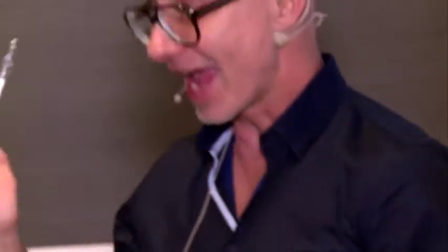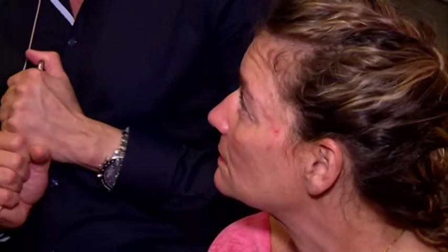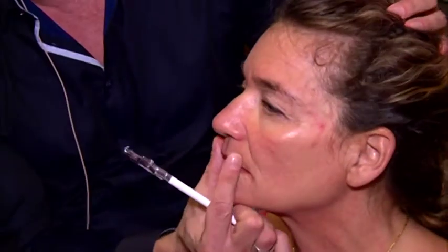Okay. Yeah. And remember anatomy, here I'm under the muscle because I'm very deep. Here I do not do, because here I might have risk of hitting the artery. But here in the central part of the mouth, you're absolutely on the safe side. Anyway, aesthetically, if I go laterally here, I broaden the mouth too much, which is not so happy in many patients. So you have to define this with the patient.